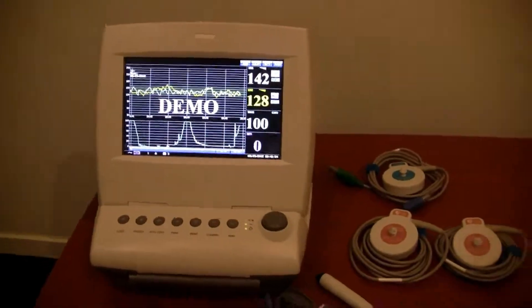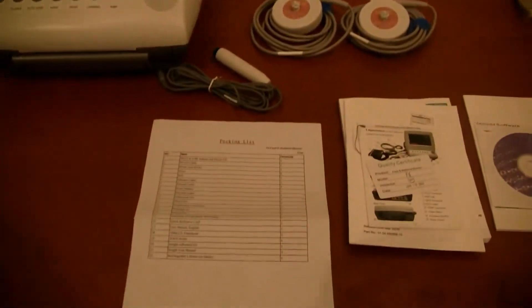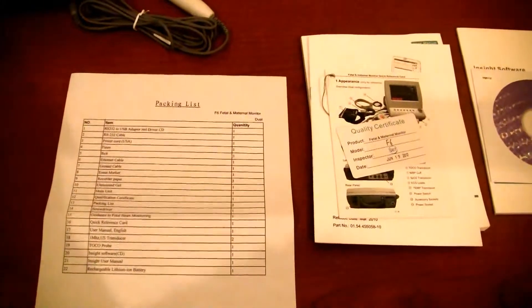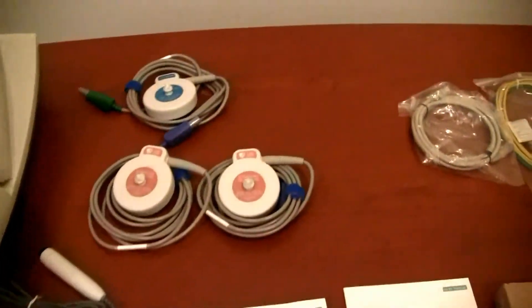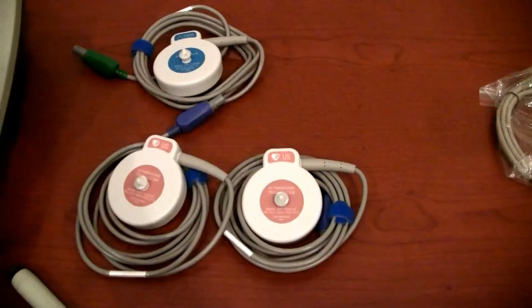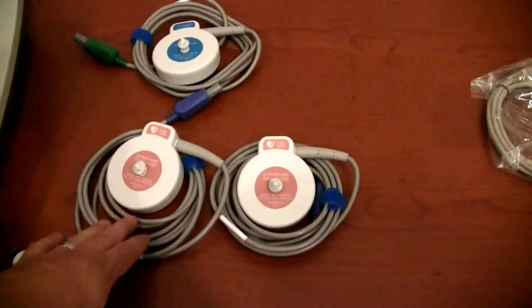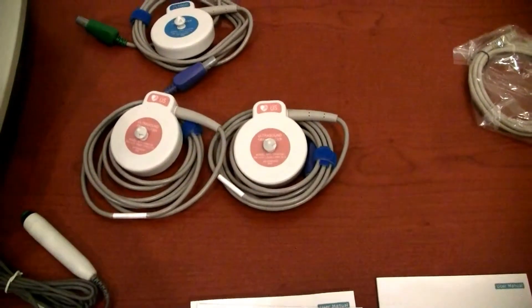Once you unpack your unit, you'll find several accessories that come standard with the device. There will be a packing slip included in the accessory box that clearly outlines all the items we're about to go through. First and foremost will be your fetal heart rate probes and your TOCO transducer for monitoring contractions. Since this is a twins' fetal heart rate monitor, it'll come with two FHR probes.